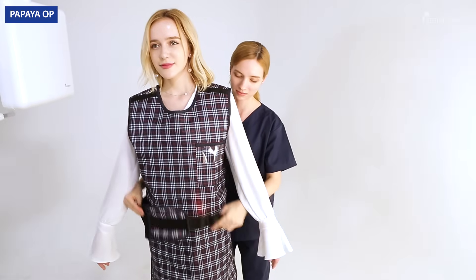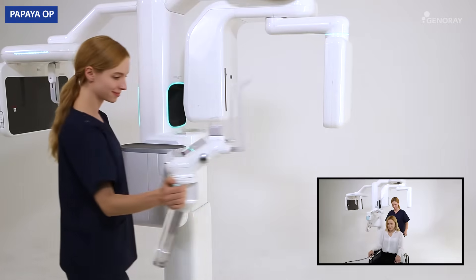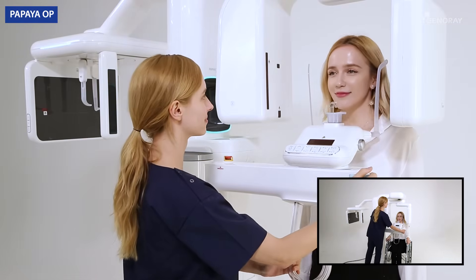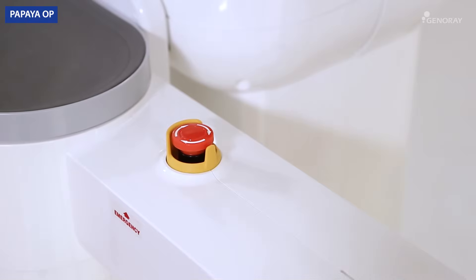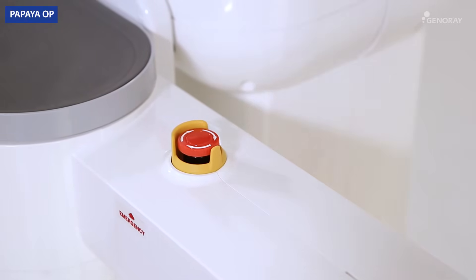Clothe the patient in a lead apron for safety purposes. Open the chin rest arm to guide the patient. Have the patient remove their accessories and place them on the storage tray. Inform the patient about the location of the emergency button in case of an emergency.